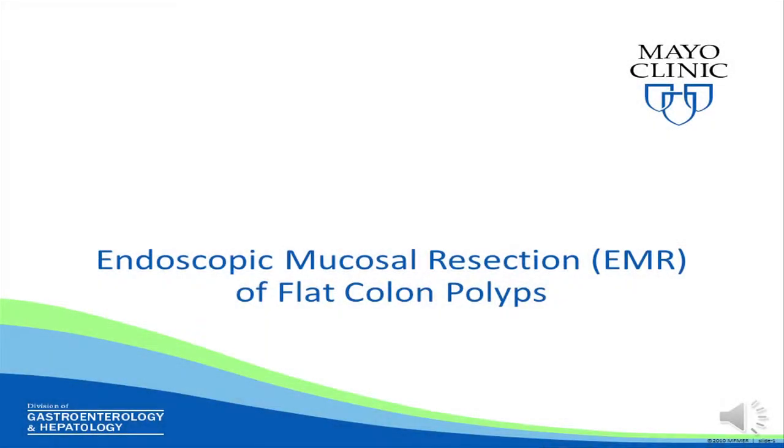In this short video, we will explain how we perform endoscopic mucosal resection, or EMR, of flat colon polyps.